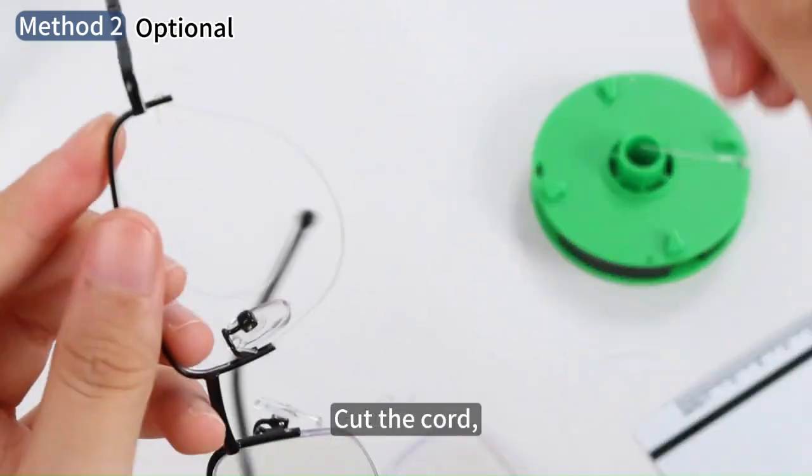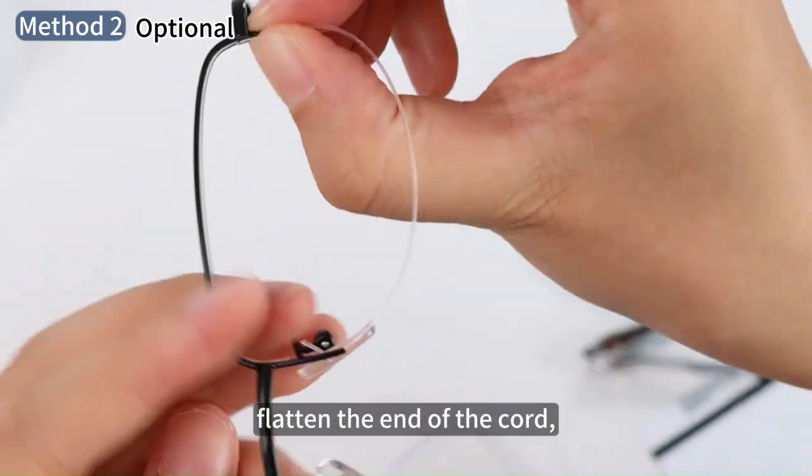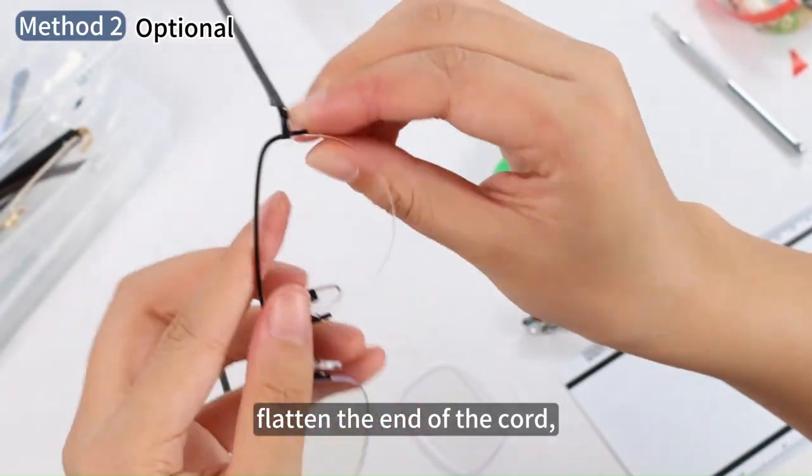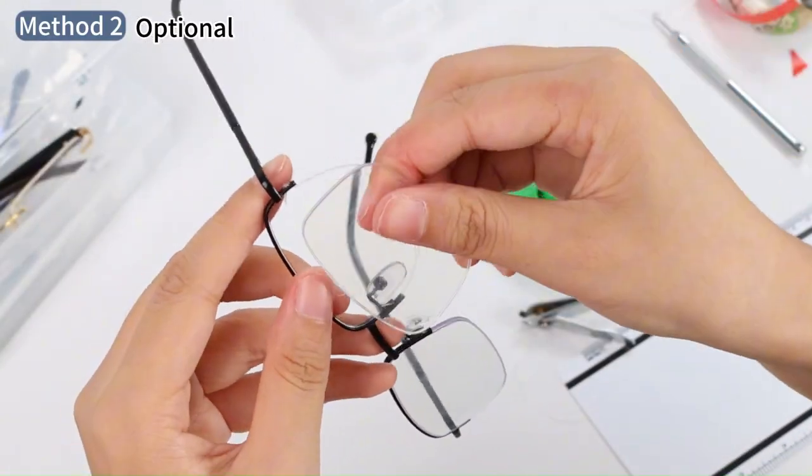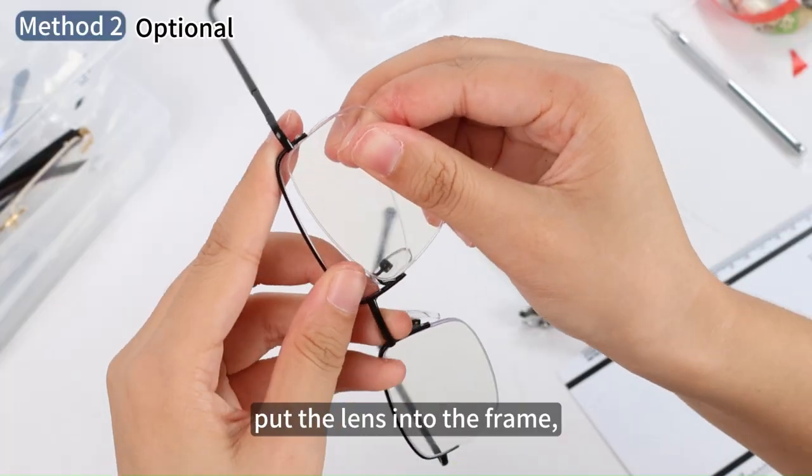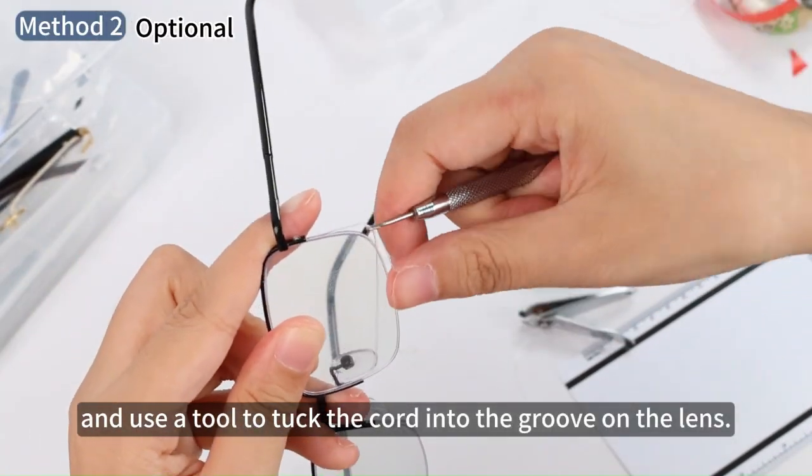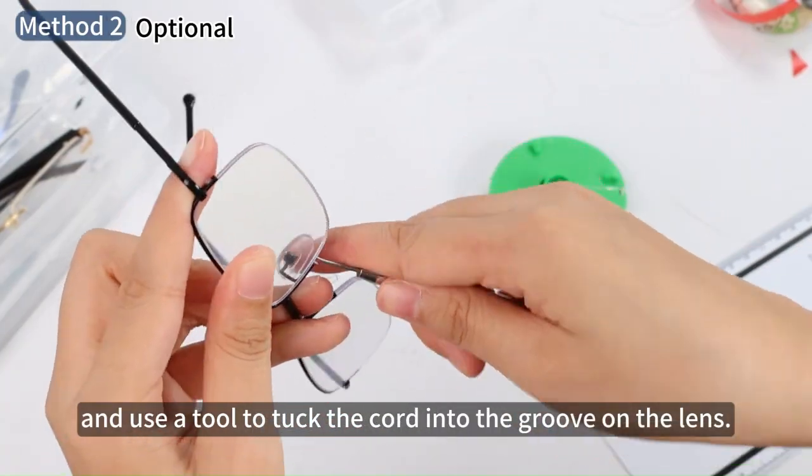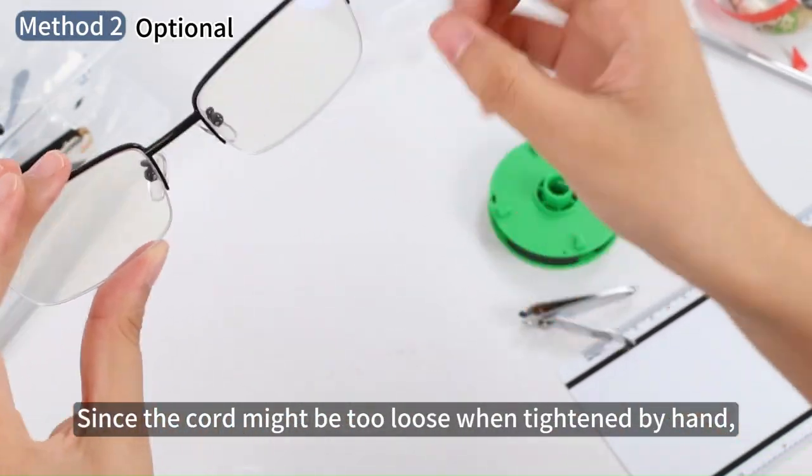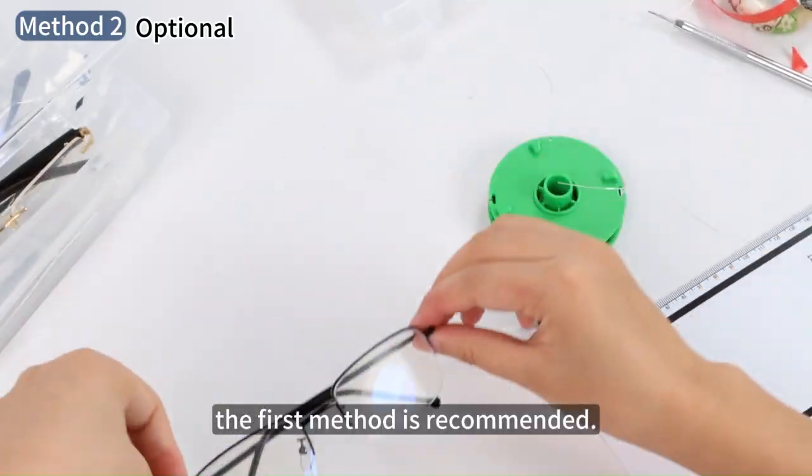Cut the cord. Flatten the end of the cord. Put the lens into the frame and use a tool to tuck the cord into the groove on the lens. Since the cord might be too loose when tightened by hand, the first method is recommended.